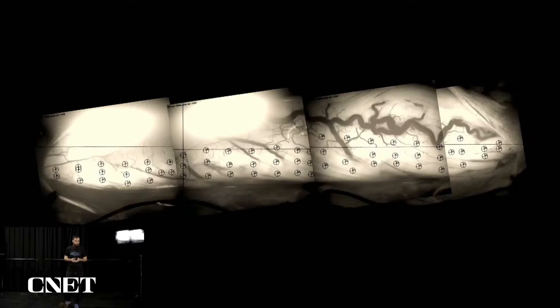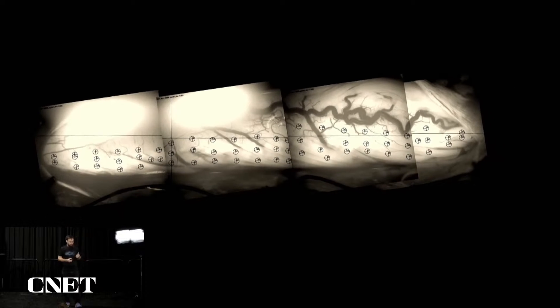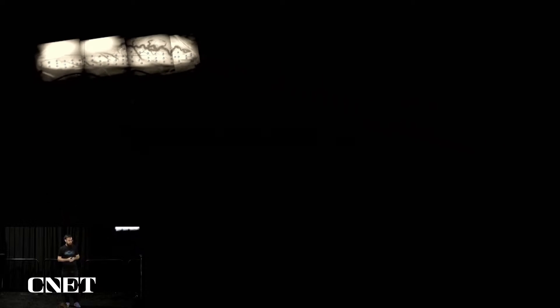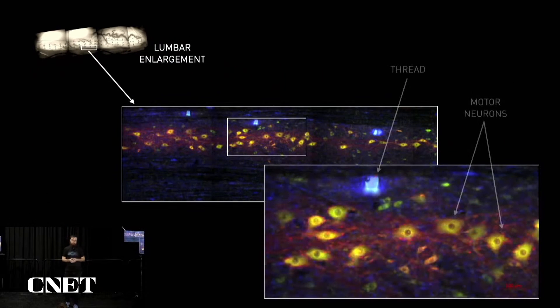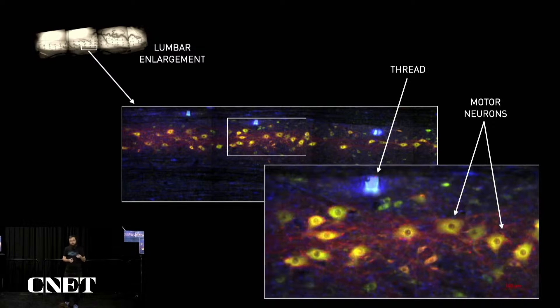And so we have done just that. Here you can see a view from the R1 robot — it's a targeting view, and we've placed electrodes across many millimeters of the spinal cord. The R1 robot is able to insert those electrodes deep into the ventral horn, into motor pools, in very close proximity to lower motor neurons. This is important because it allows them to have a localized connection to those neurons and activate very precise movements.